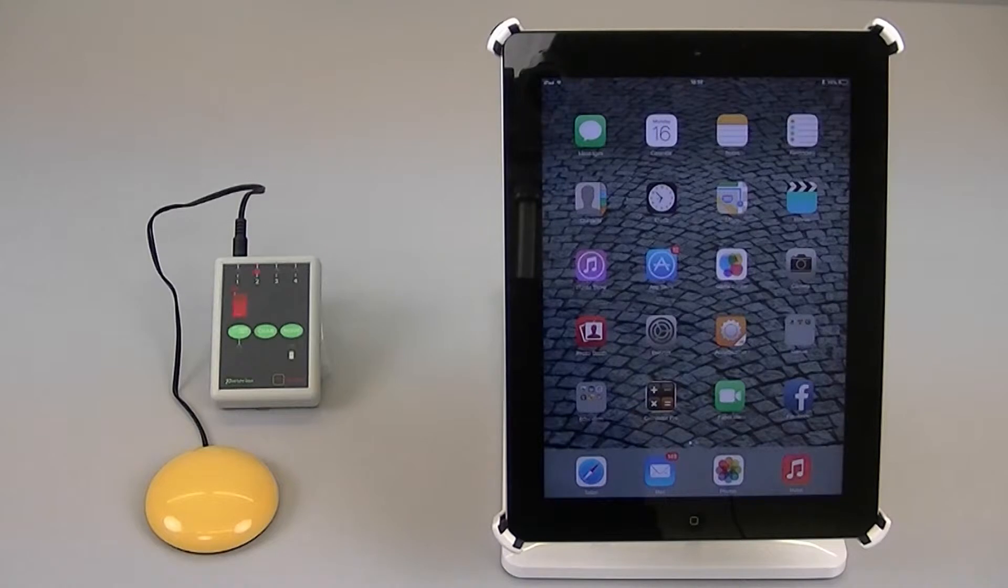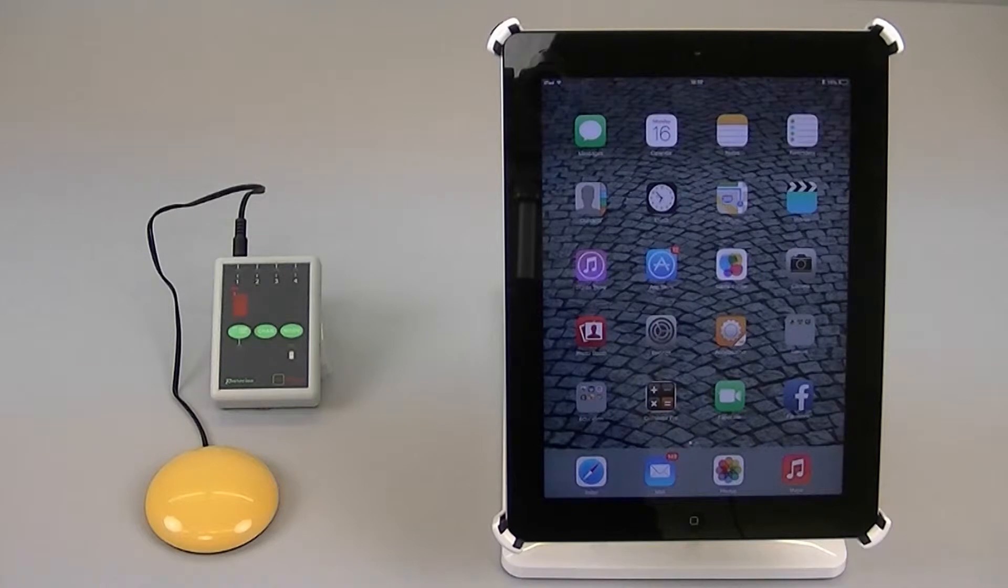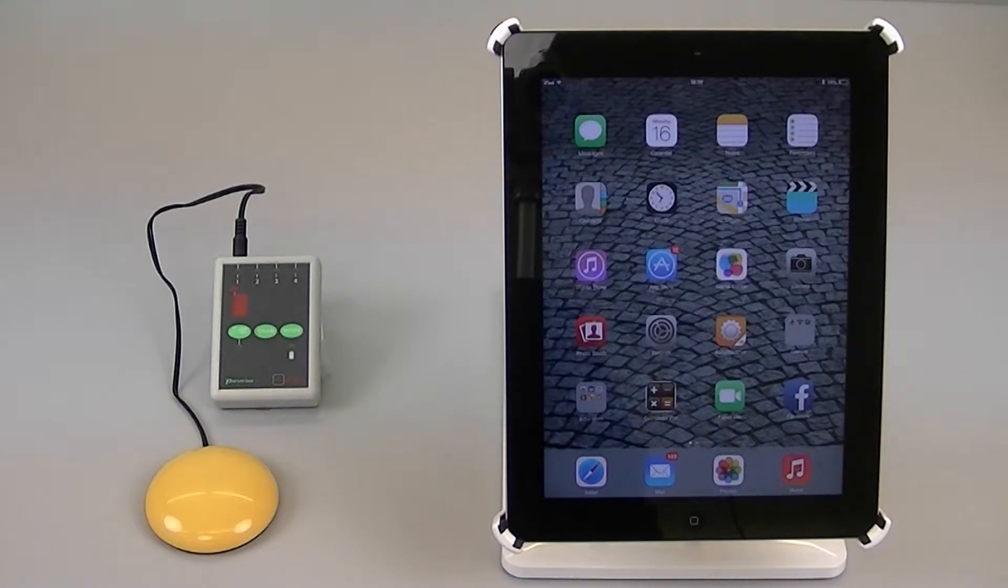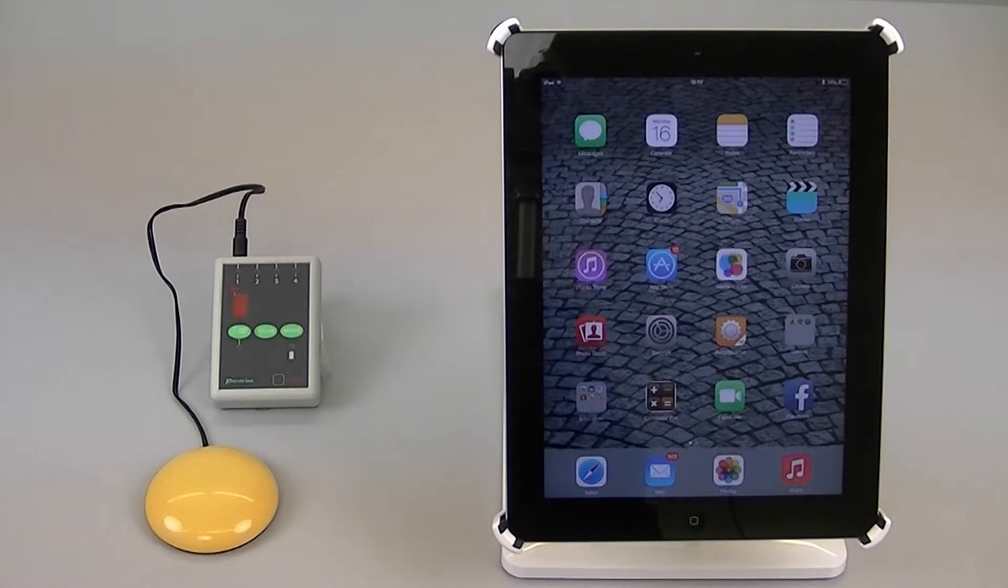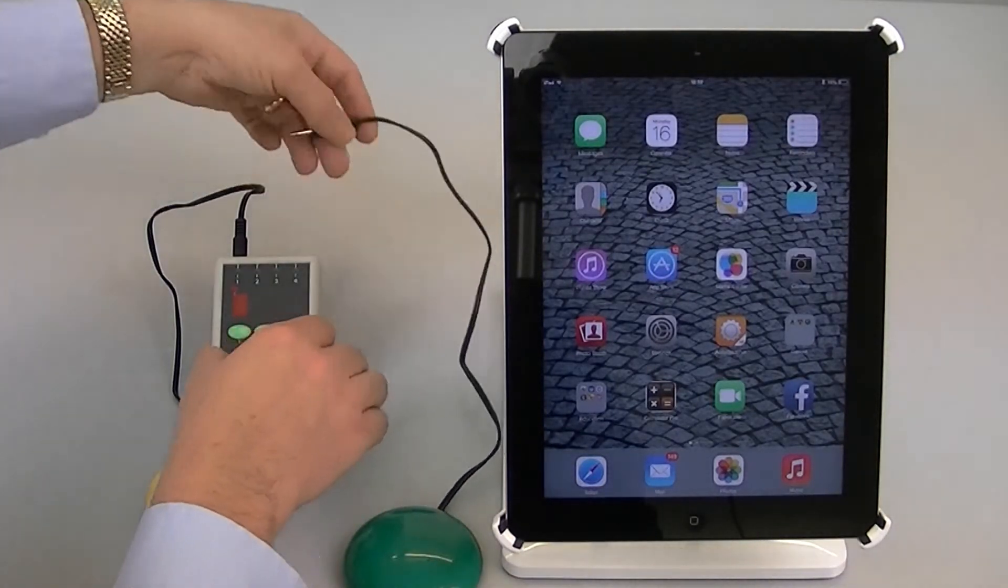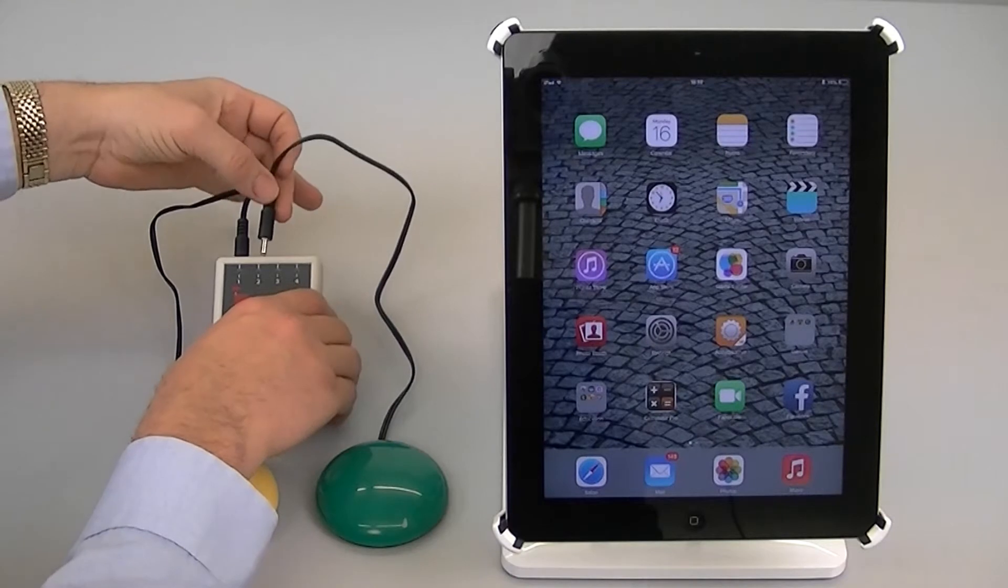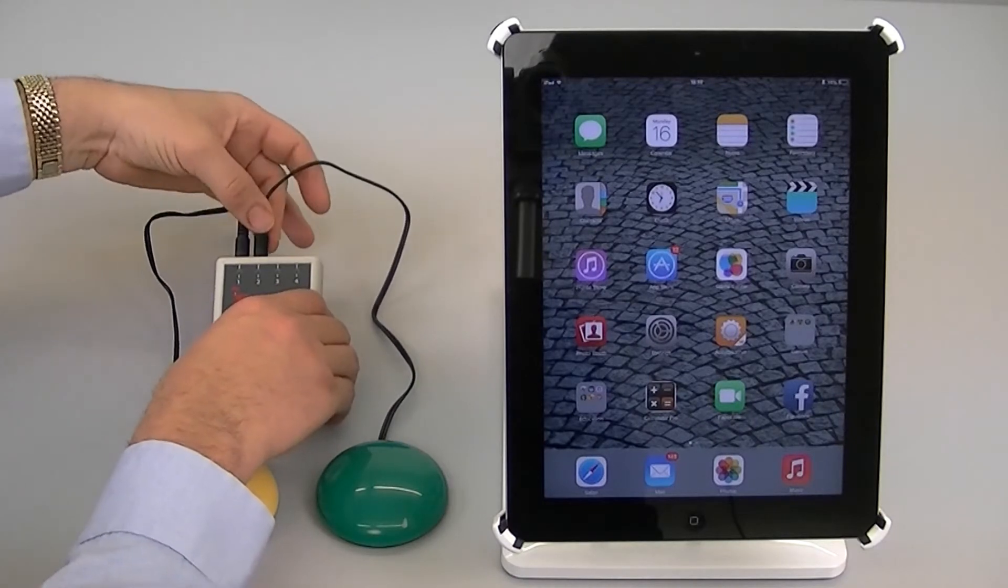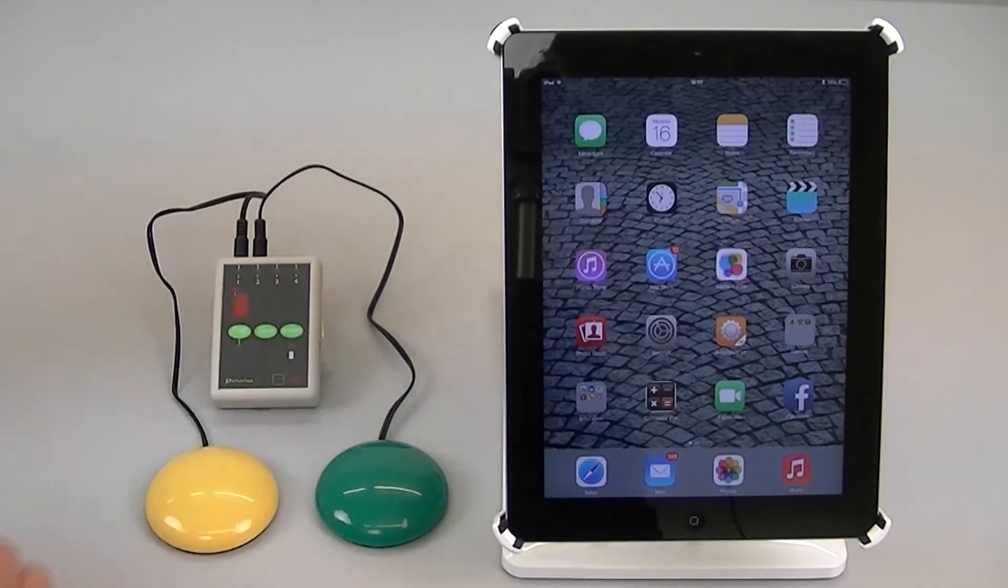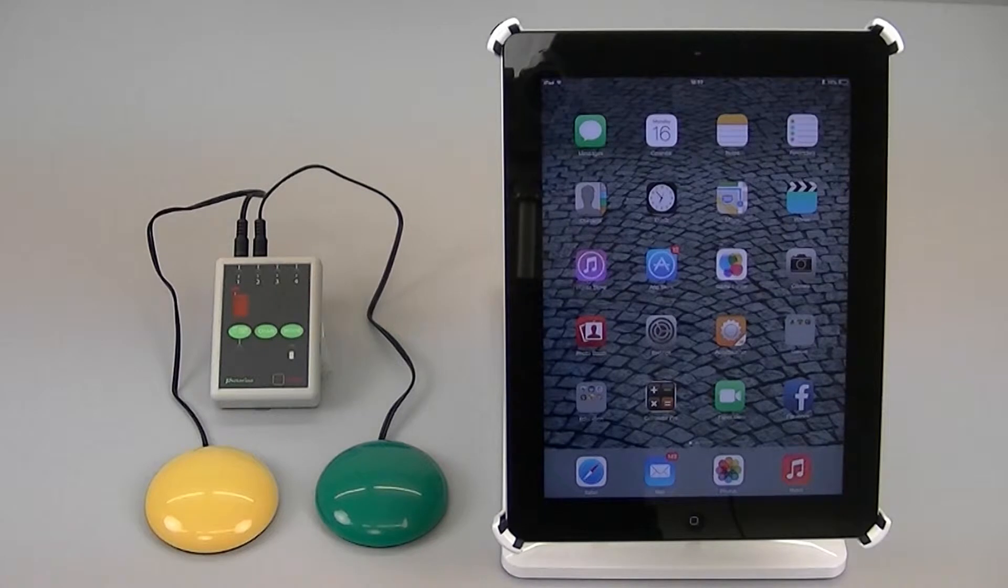Now this doesn't have to be set up in switch control. Home is an inherent function and it's understood from anywhere, so you don't even need to be in switch control, it will simply work. So if I now plug the green switch into channel 2 on my applicator, that will now implement the home function.